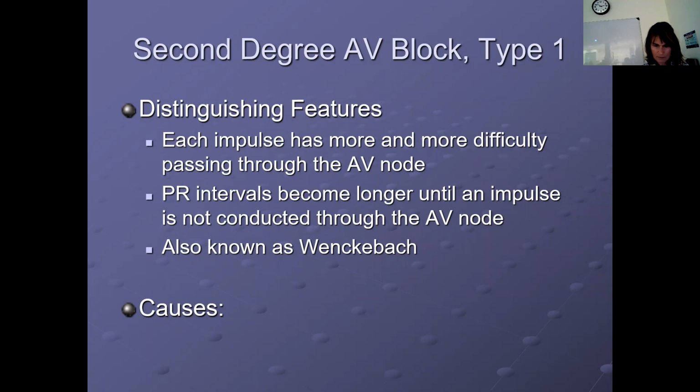Remember this and going on. I like that: the interval gets more and more, and then stops. Going, going, gone.